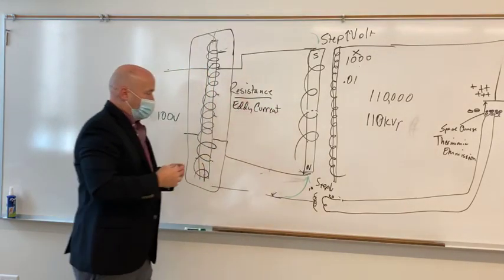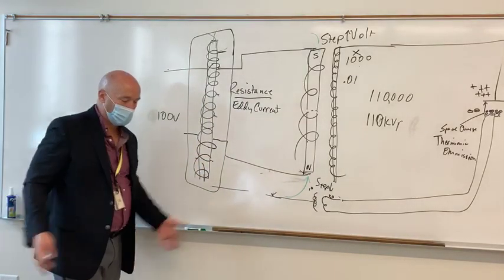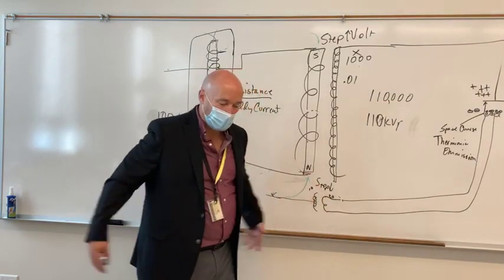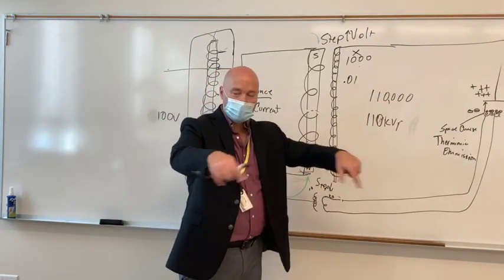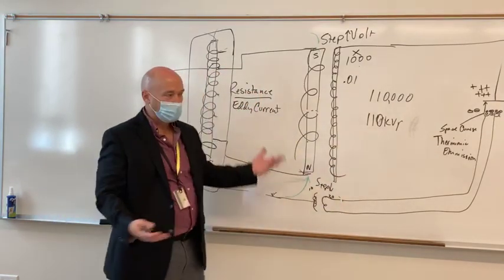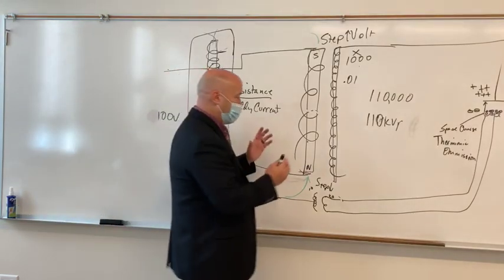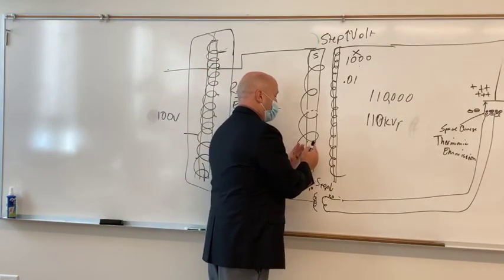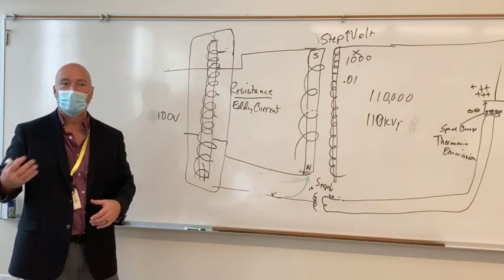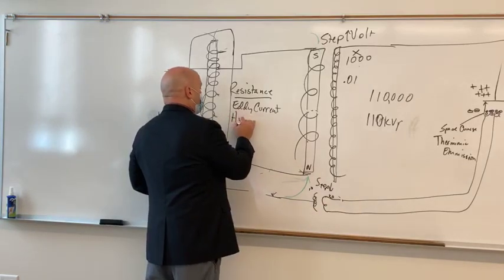All right. So you ever stood on the bank of a flowing creek or a river, and maybe there's some branches down into the river, and you see the water going down and it hits the branches and it starts spinning? You ever seen that? That's what you call eddy current. That's all it is. The eddy current is just spinny little currents is all it is. And even though we put an iron core to reduce those, they're still present. They still happen. And the other is what we call hysteresis.